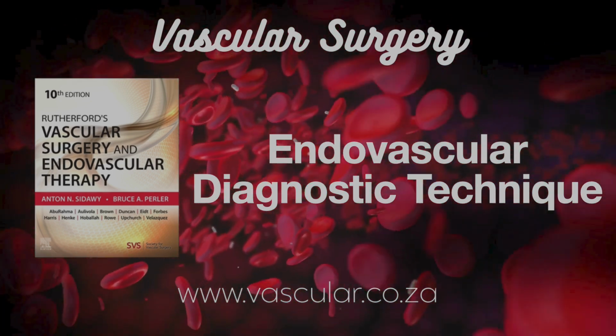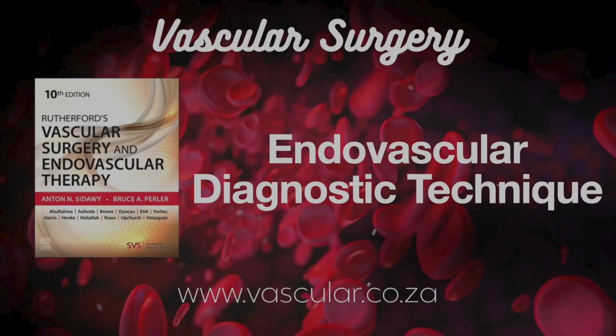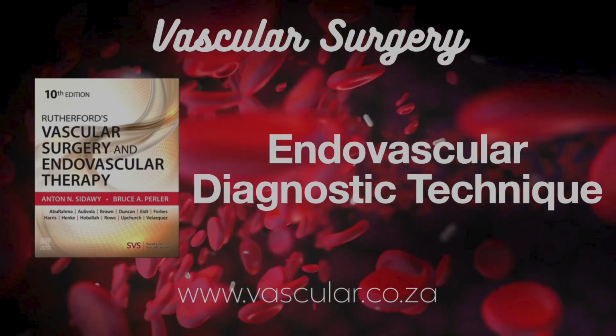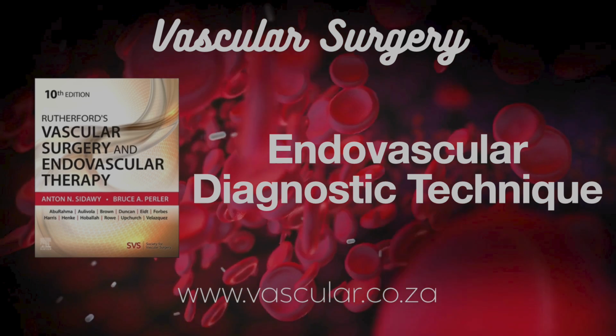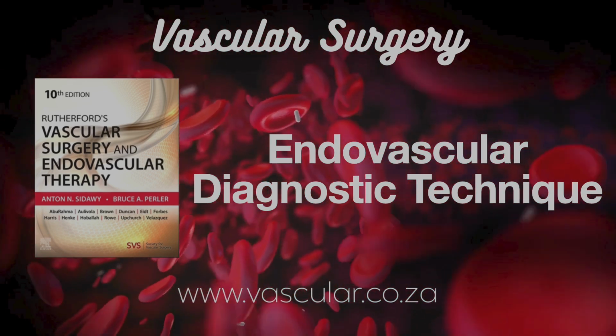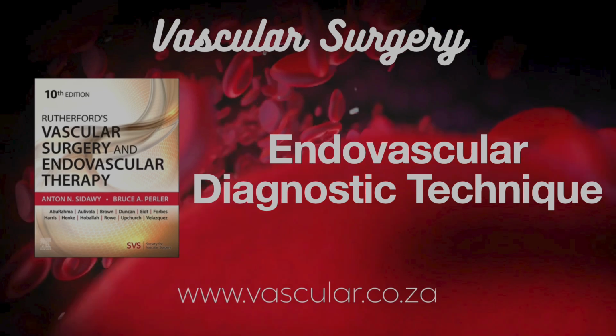And AV fistulas at the access site? Less common. They tend to happen with more distal punctures involving the SFA or profunda and nearby veins. Many are probably asymptomatic and close on their own. What if they persist and cause symptoms? Usually it needs open surgical repair. There have been some attempts at using covered stents, but that's not standard practice yet.